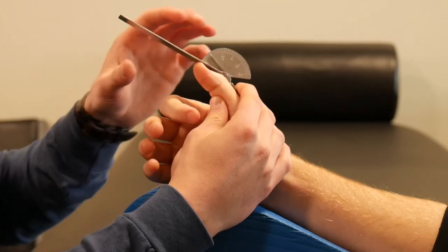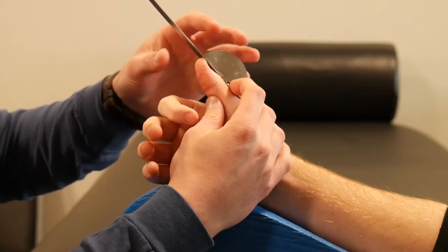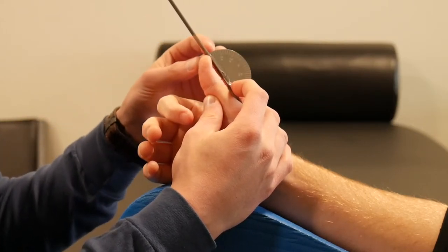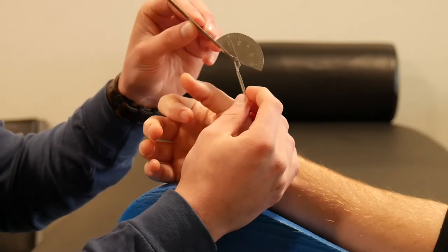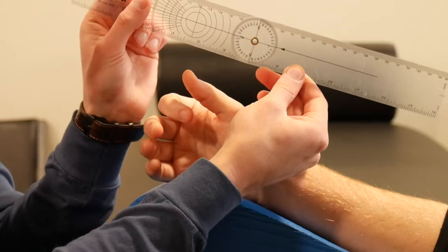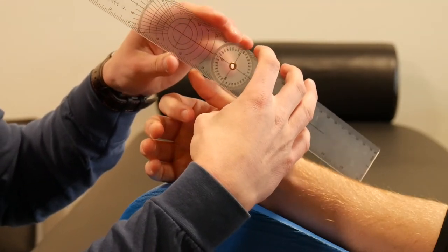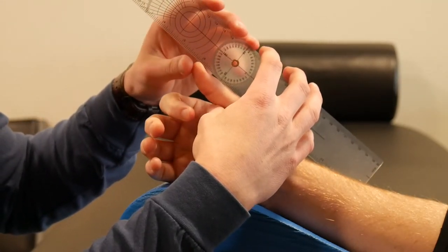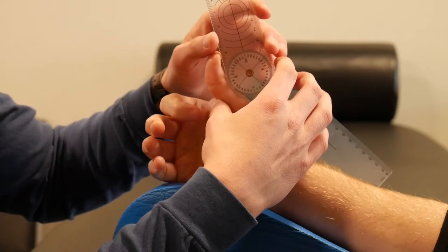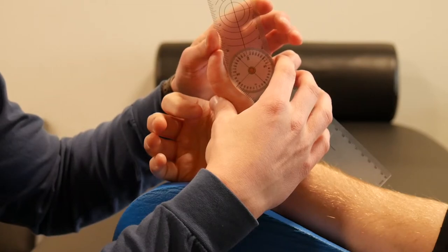For IP joint extension, opposite of that — have the patient extend their IP joint. Many people have zero degrees of IP joint extension; some have hyperextension, as in this case. A stainless steel goniometer maxes out at zero, so when you have hyperextension you'd want to swap to a goniometer that will allow you to measure it. Align it with the dorsal aspect of the finger, allow the patient to actively extend the IP joint, make sure the goniometer is flush with the digit and the axis is over the IP joint, and record the hyperextension measurement.